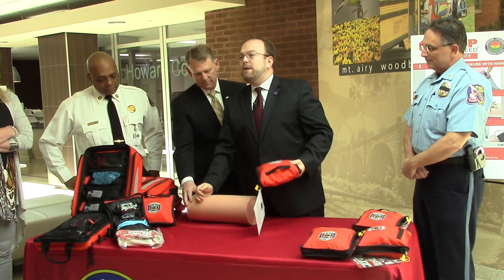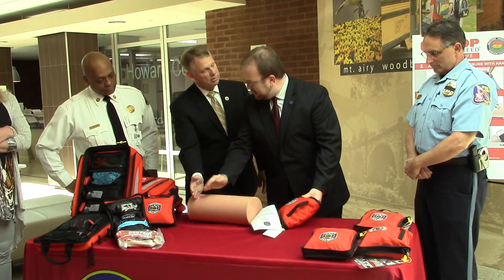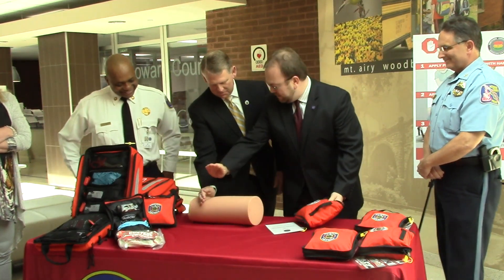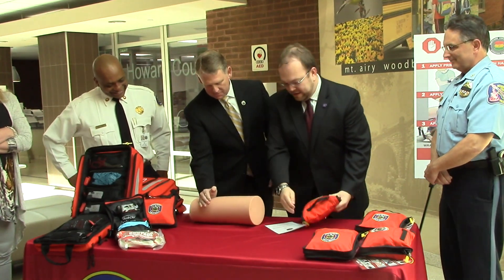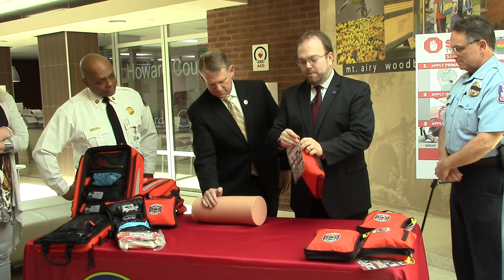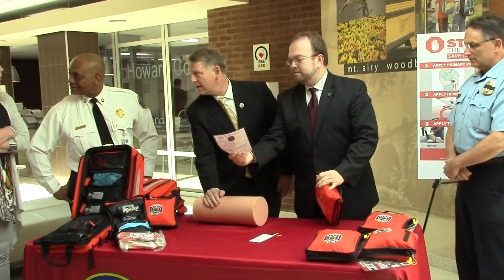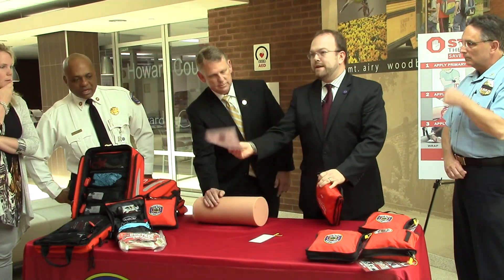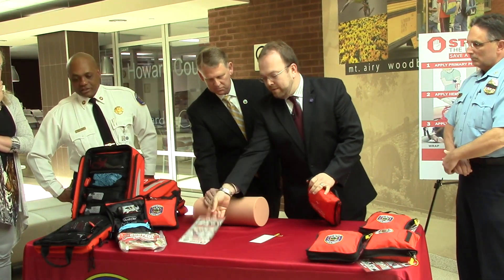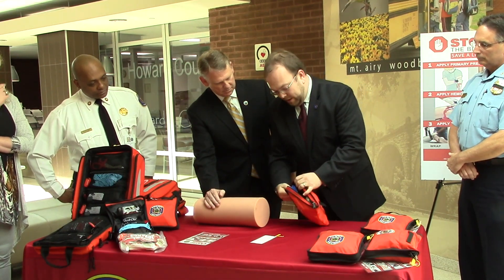We're going to send someone to go get one of the bleeding control kits — we happen to have one right here. As we're holding pressure, with the heel of your hand right down there, hold pressure nice and tight. We now have one of our training kits that we're going to open up for the purposes of the demonstration. We have some just-in-time instructions, which we encourage our users to have out there so they can see what to do.